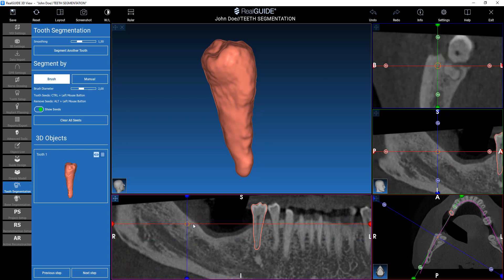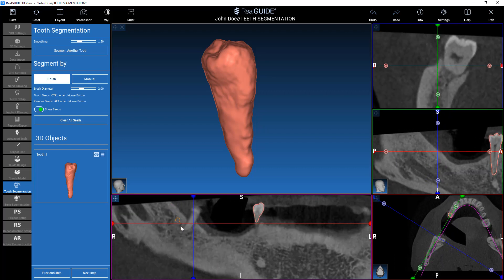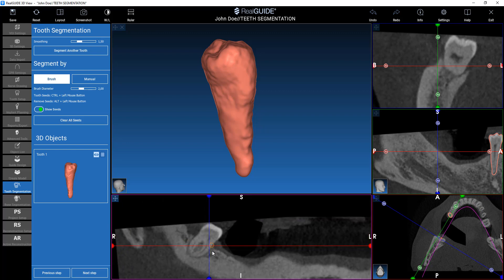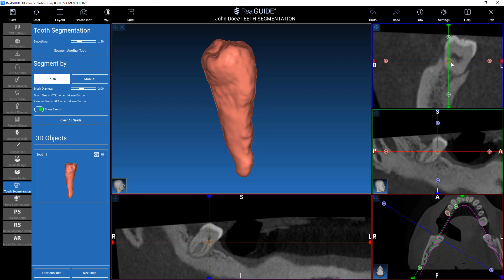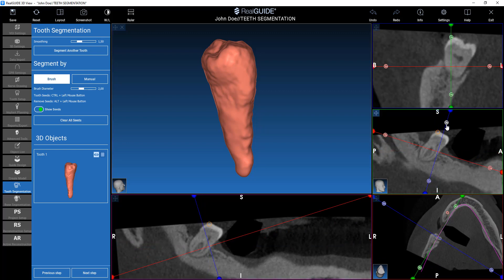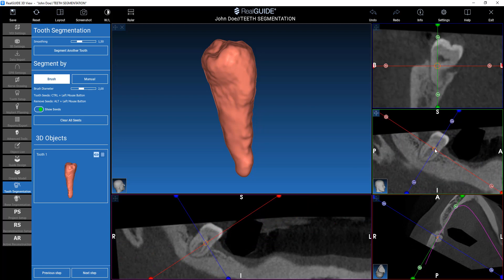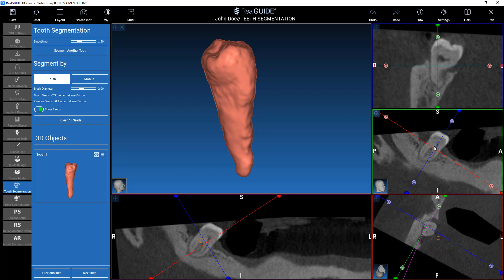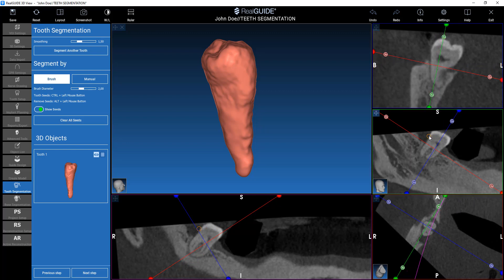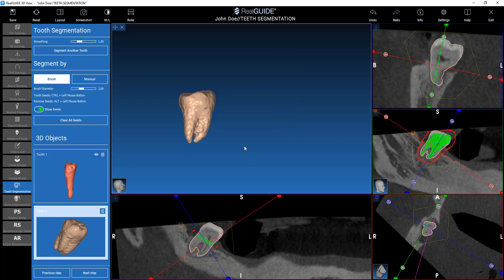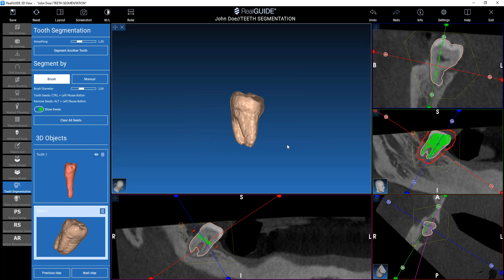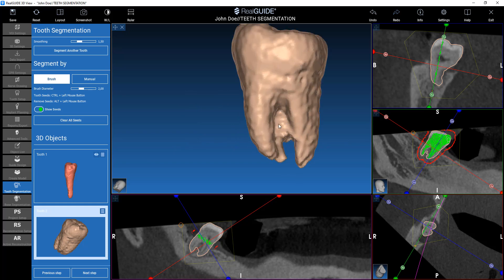We see now how to segment a tooth with multiple roots, which might require some more operations to be correctly extracted. I suggest aligning the multiplanar images to the tooth axis. Then we work the same way — click the Ctrl button, outline the tooth where we see the roots better. We can hide this tooth for now, and we see the result is not bad, but we need to fine-tune this part of the tooth.